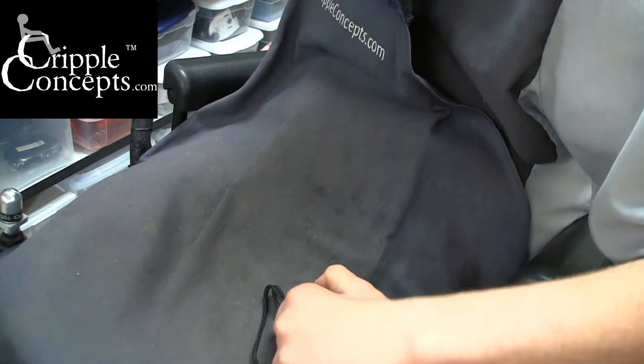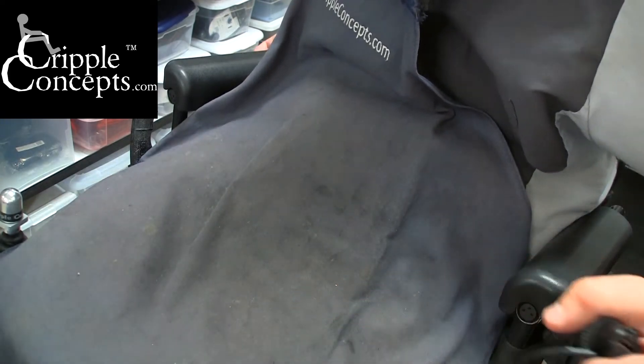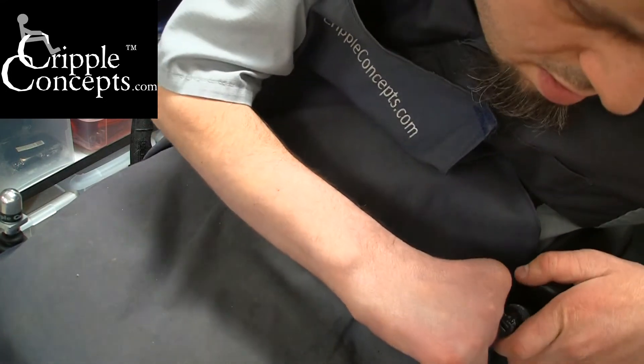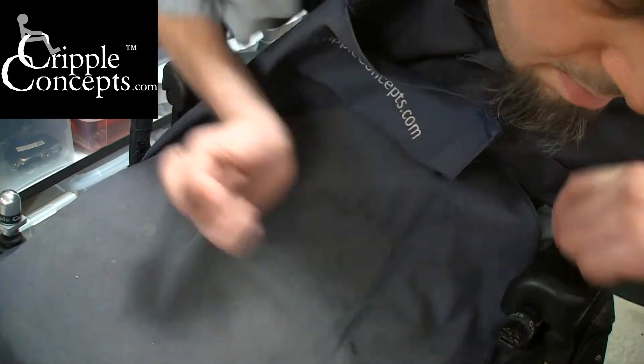They simply plug in to the charge port on the wheelchair or scooter — in this case it's in the front of this armrest on my Invacare chair. Plugs right in.